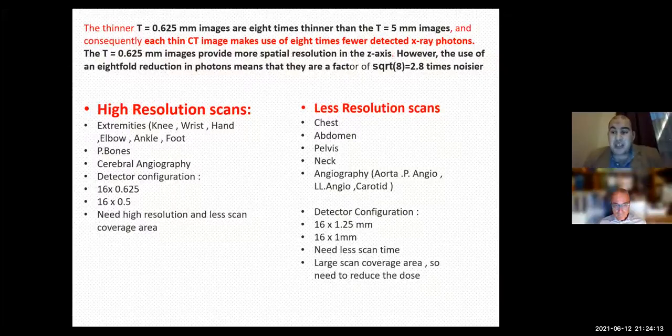If you scan the patient using 16 rows of detectors with thickness 0.5 millimeter in case of CT abdomen or CT abdomen triphasic, you take longer time, you expose the patient to higher dose, and you will not get a higher difference in image quality, because there is no probability to detect any lesion in CT abdomen or CT triphasic that reaches 0.5 millimeters.